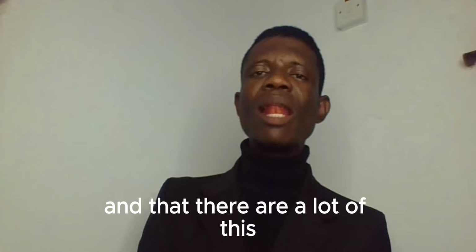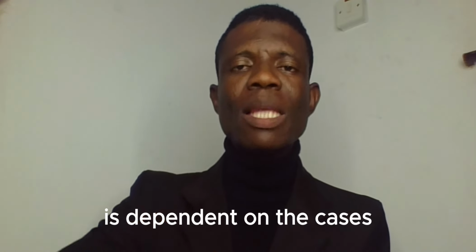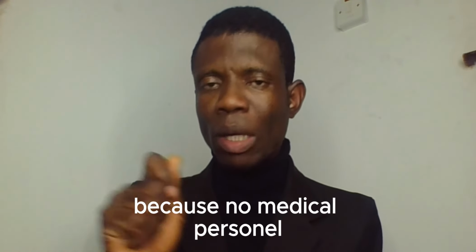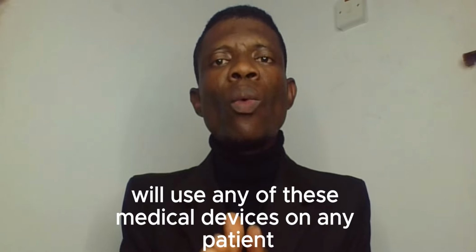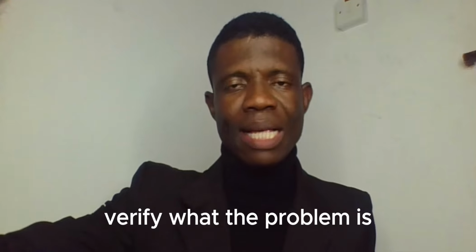There are a lot of these medical devices being used in the hospital, but their use is dependent on the cases being presented to the hospital, because no medical personnel will use any of these medical devices on any patient without first verifying what the problem is.